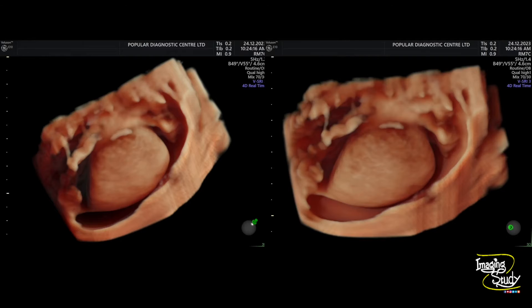If you have a 3D transducer and you get a patient with hydrocele, always try to practice 3D ultrasound to take this type of picture.